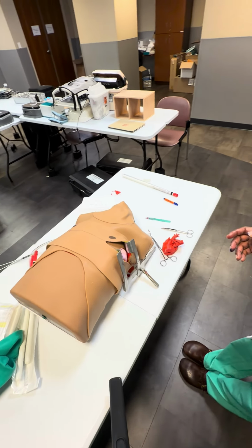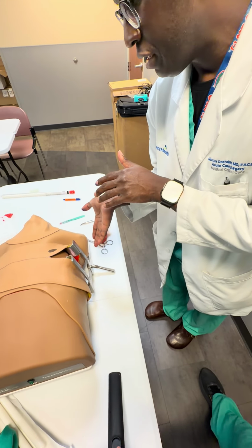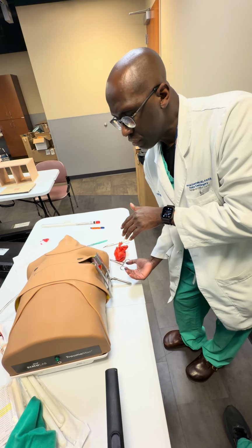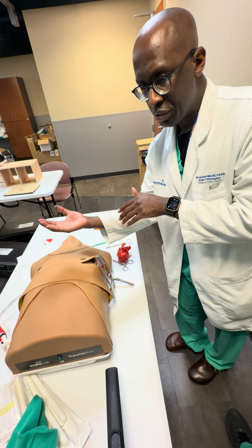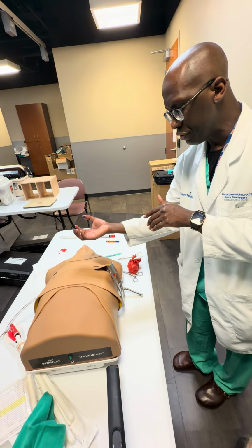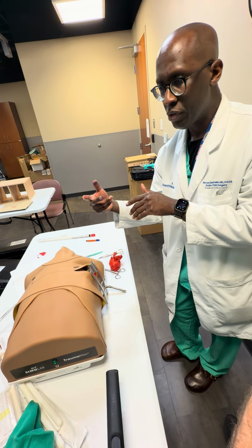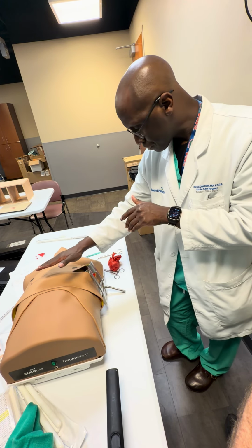At that point, after I've inspected for any injuries, I'm going to try to augment my hemodynamics. So what I'm going to do is take my hand, slide it at the level of the rib cage all the way down, follow the ribs to the spinal column, and just above the spine, you should feel the aorta. Above the aorta will be the esophagus, which should have an NG tube. But essentially, you can clamp that aorta with either a vascular clamp or a Satinsky clamp, or even simply just your hand to cross clamp it.